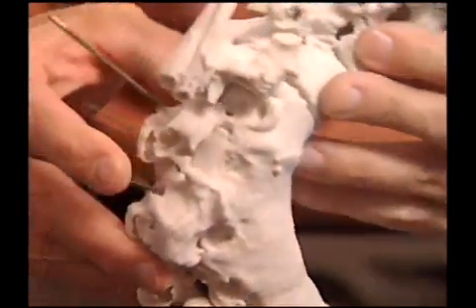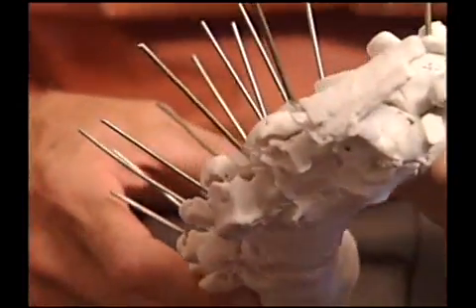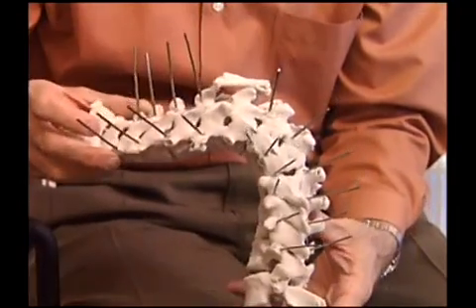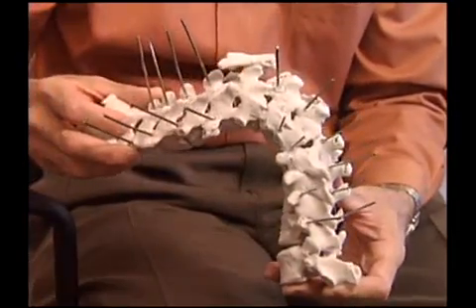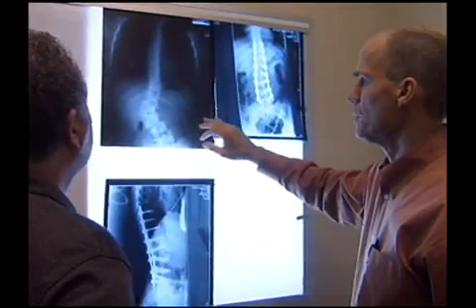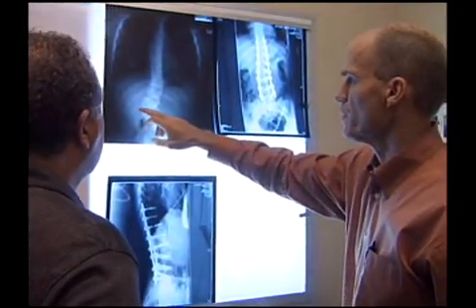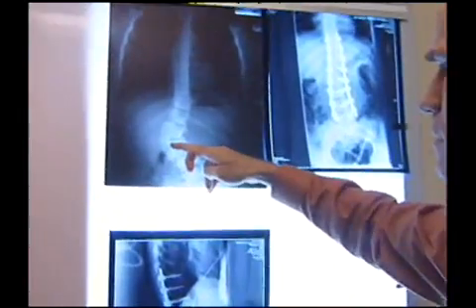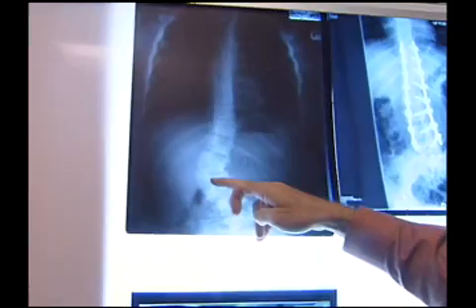Correcting this boy's obvious kyphosis and his severe scoliosis. So this was a model that we operated on preoperatively, just so we could find out where those pedicles all were in a distorted spine. This is the last boy we did. We saw the model just a few minutes ago. This is the hemivertebral body that is so well represented in the model that we were showing before.